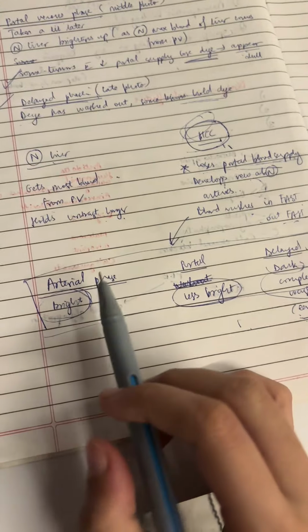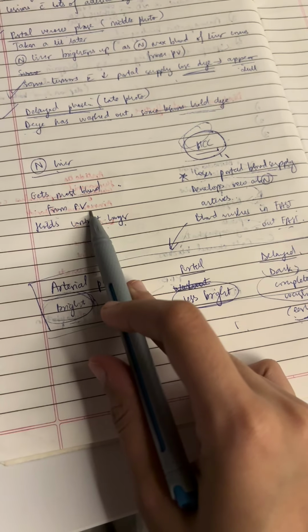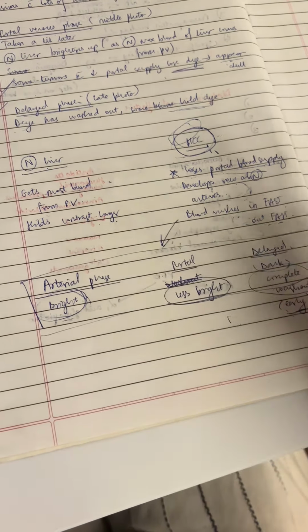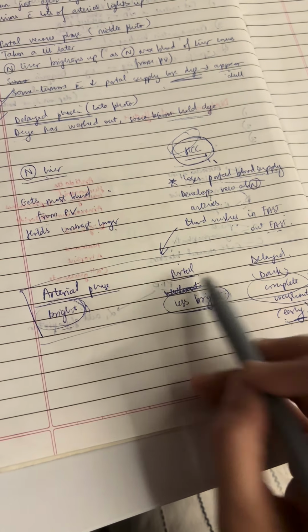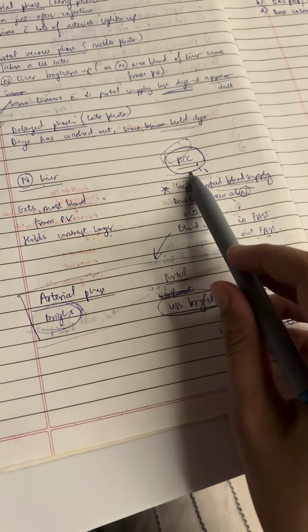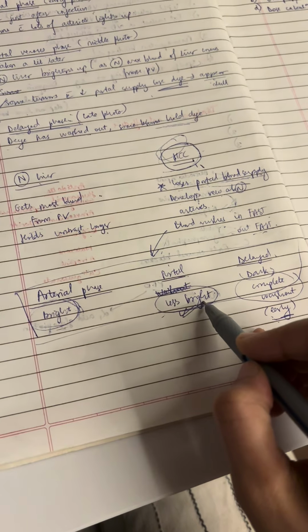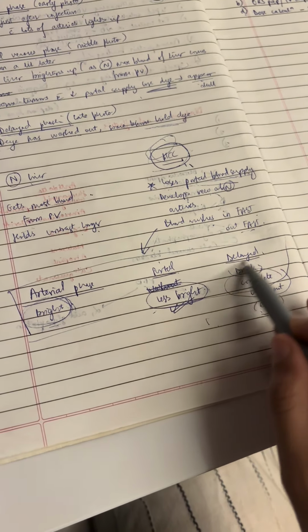Let's see. In the arterial phase, it will look brighter than the normal liver, right? Because it has more arteries than the normal liver. It has more abnormal arteries rather. In the second image, in the portal phase, the normal liver is filling up with the portal blood. But since portal blood supply of the HCC is reduced, it will appear less bright than the normal liver. And in the delayed phase, it will appear completely dark.